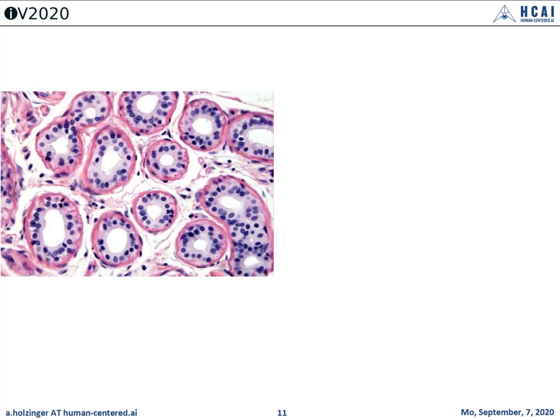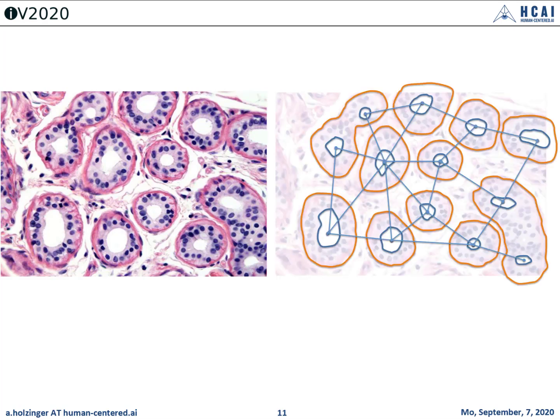And such structures are observed as recurring patterns in histopathology. And here graph theory can be of great help. The computed graphs, for example, can be processed then via graph neural networks, which are currently en vogue, to further enhance graph extraction by improved node classification, and we can do link prediction, for example. So graph explainability is an upcoming, very important research topic which will help us for explainability.